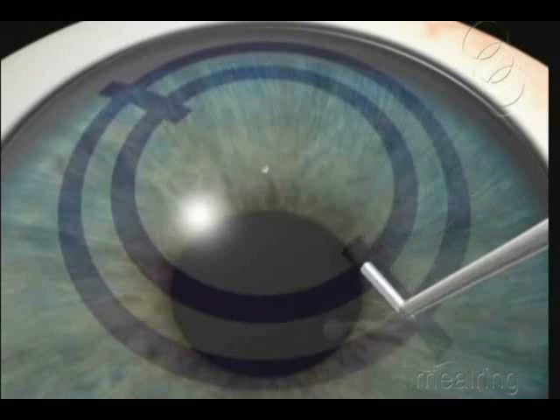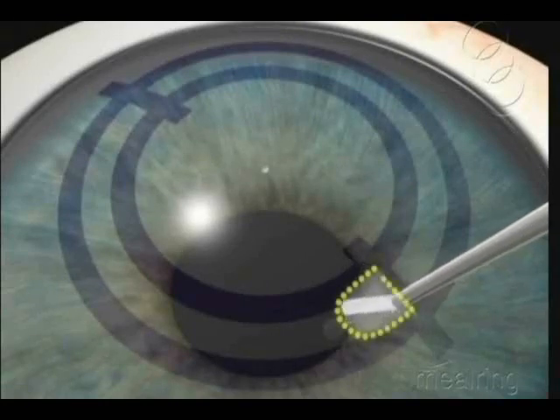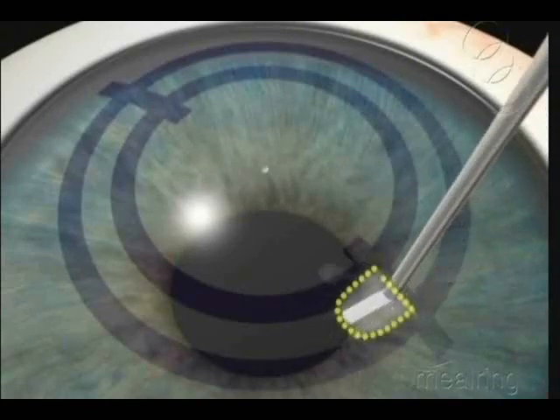Insert the pre-delaminator until the bottom of the incision. With a mild rotatory movement from side to side, open a small pocket towards the planned tunnel.